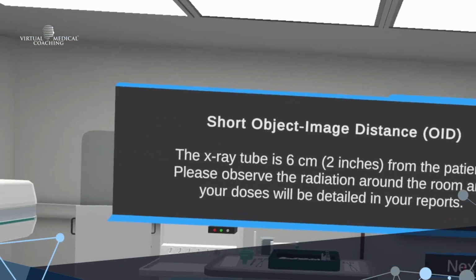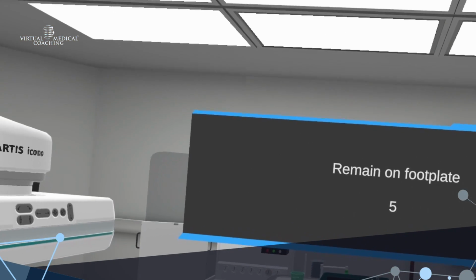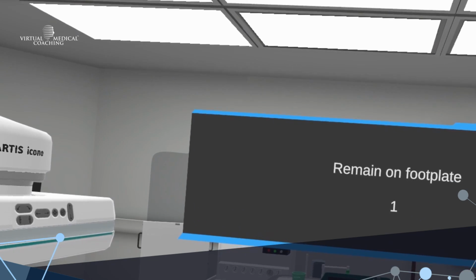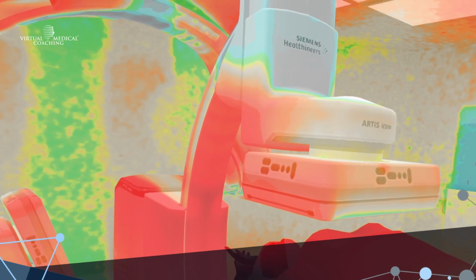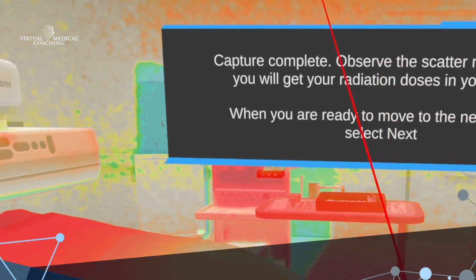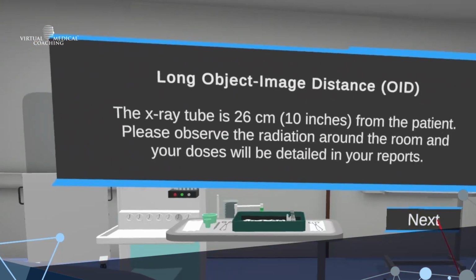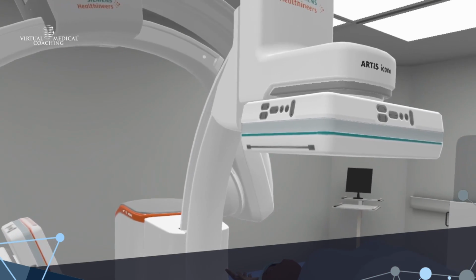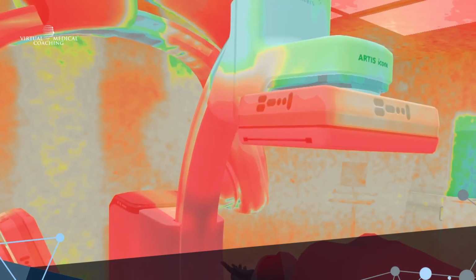So we talked about flat panel detector position. This is nice and close, the way it should be. Again, I'll be able to show you in the report. The dose there, I don't actually see, it was something like 78 microsieverts. And then we've gone to a maximum height. And hopefully I look at my wrist again to see what the dose is.